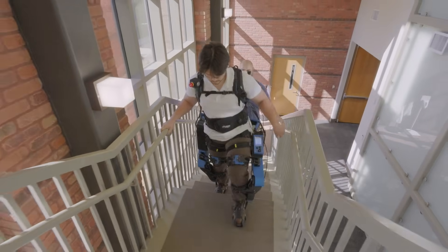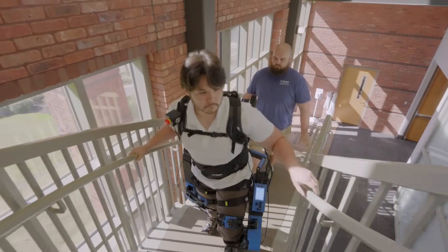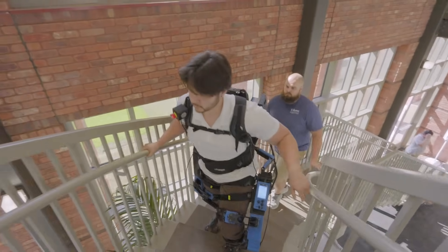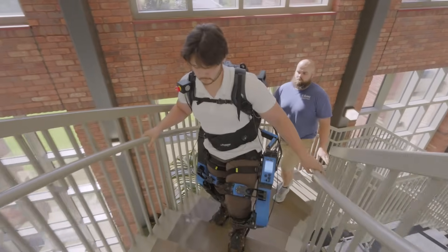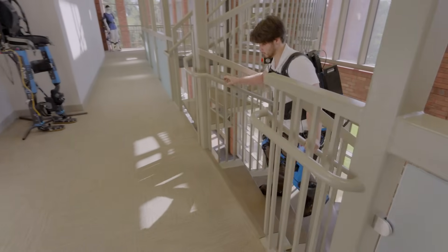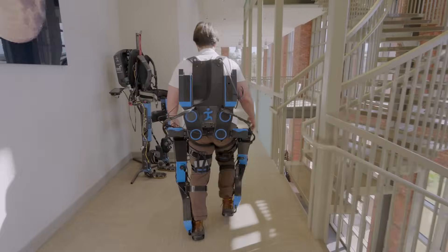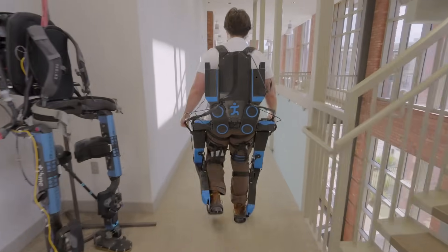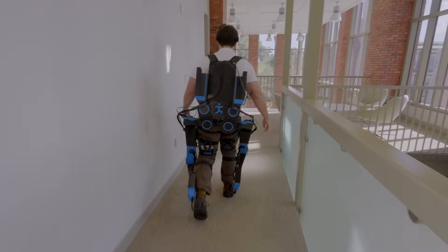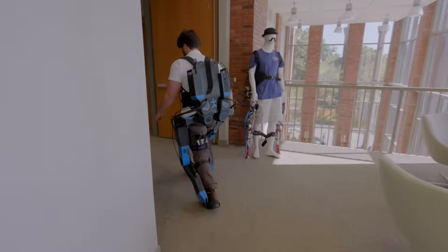AVA itself assists the hips, knees, and ankles using actuators, and it is powered off of two batteries in the backpack. The device uses a gravity compensation style control, where it reads sensors on insoles inside the shoes, and then understands where the joints and linkages are placed based off of a real-time updating dynamic model of the system. Using that, it offloads the weight of itself from my body through actuator joint torques.